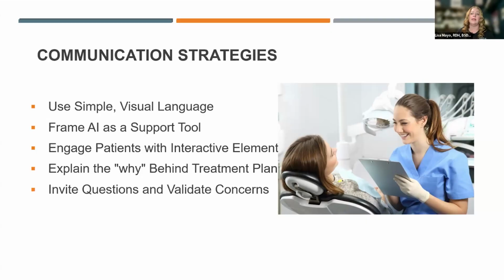So I like the AI can come in, and what I also like about the AI is the dentist can come in and go, oh yeah, I know AI picked that up, but this is something else. I'm not worried about that. And they'll just pop off the different colorations that the AI may have detected, because the AI is going to detect everything. It's not a human being. It's not a doctor. It's not a trained DDS or DMD that's going to come in and be able to tell us exactly what is going on tooth by tooth. So we still need the expertise of the human beings, but the AI really helps from a conversation piece with patients.